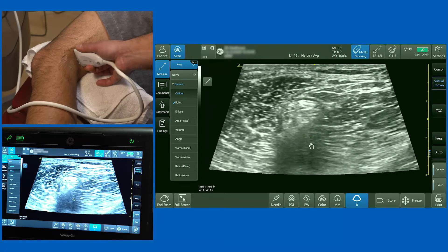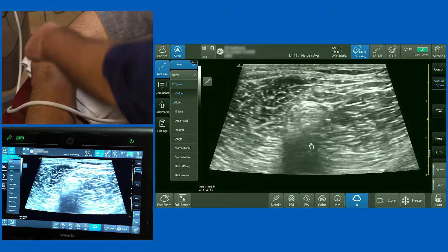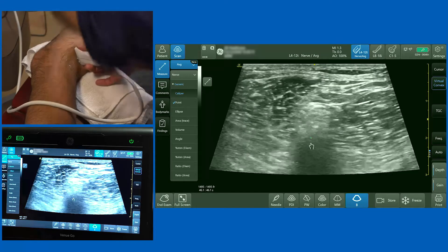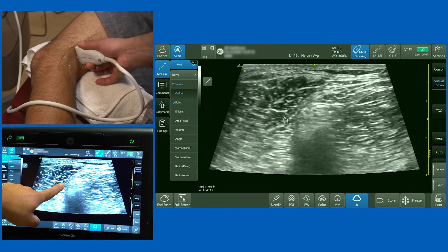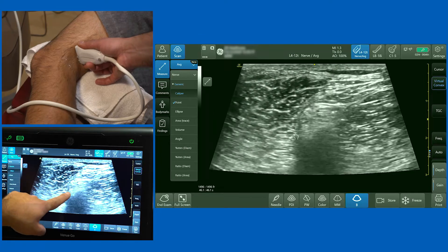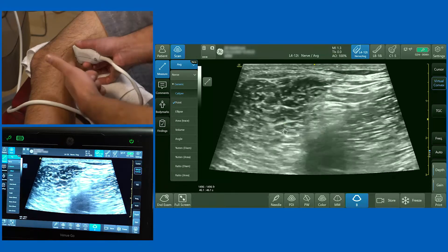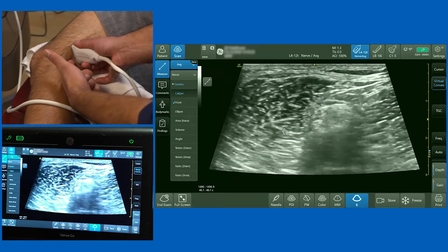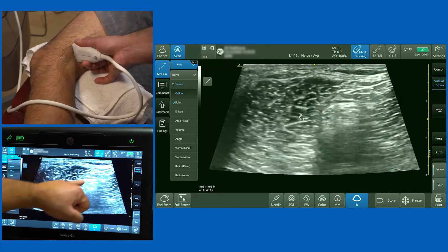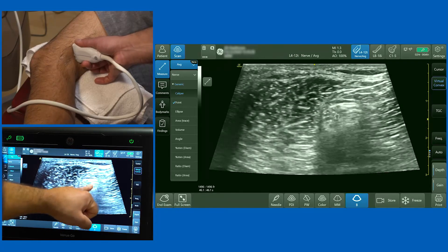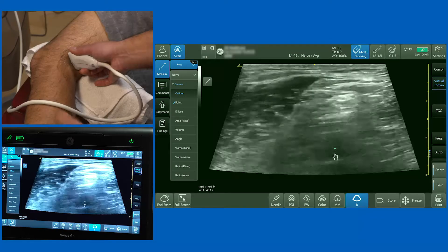To perform the nerve block here you have two options. You can come in-plane, bringing a needle in from the lateral aspect of the screen aiming to put local anaesthetic above and below the nerve, avoiding the popliteal vein and artery that lie below it. Alternatively, you can bring a needle in out-of-plane — similar to doing a central line — and you will see the dot of your needle come down, aiming to pop the needle between the two structures, not into either of them.